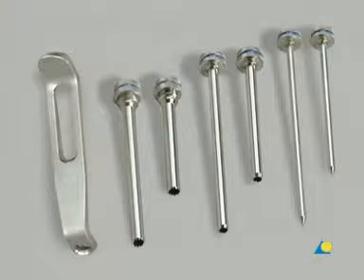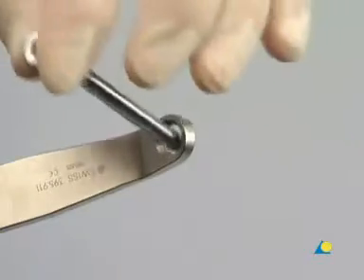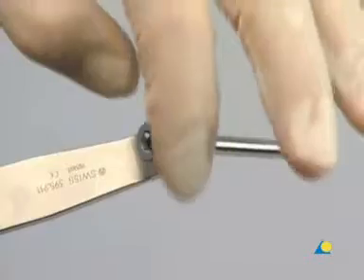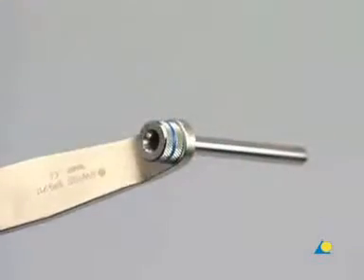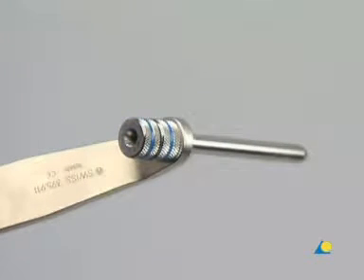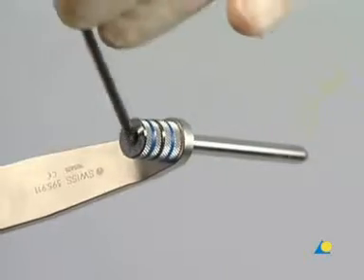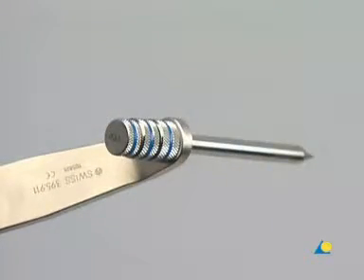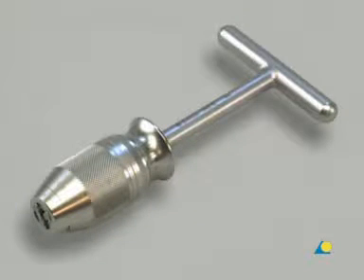Also needed is the drill sleeve assembly, which includes the handle for drill sleeves, both the long and the short 6.0 and 5.0 threaded drill sleeves, and the long and the short 5.0 and 3.5 drill sleeves, as well as the long and the short 3.5 trocars. The universal chuck with T-handle may also be used to advance the Schanz screws.